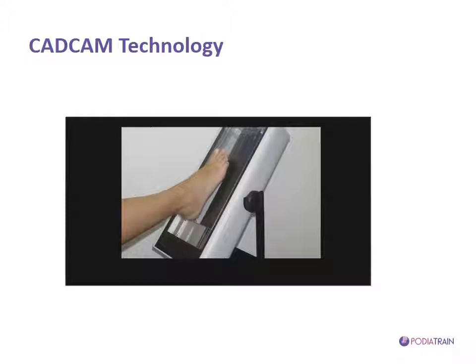We know that this material is not biodegradable, so it will be a potential hazard once we inhale it. And with a CAD/CAM system, we will not be inhaling this material, first of all, because once we manufacture the device, it will be in an enclosed area with a vacuum that will extract all the dust.